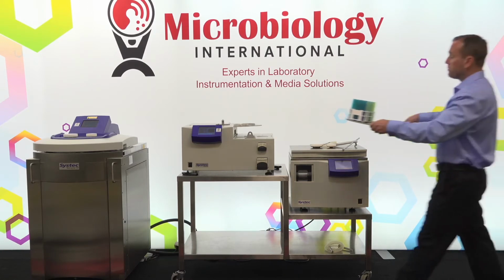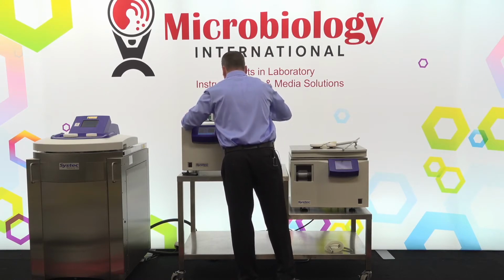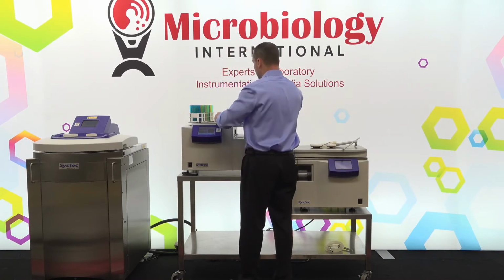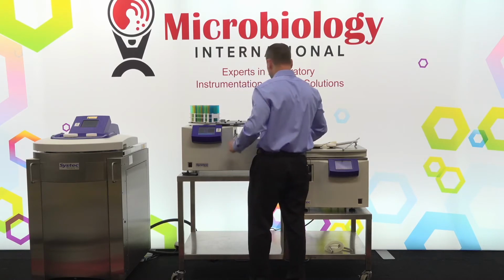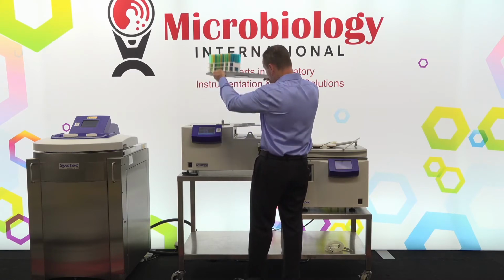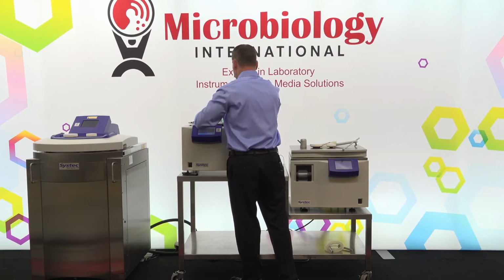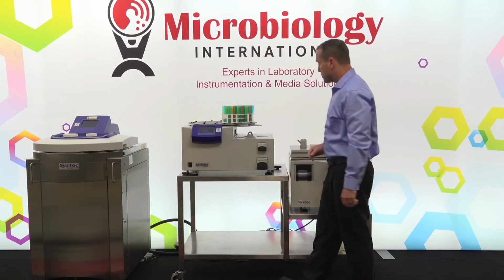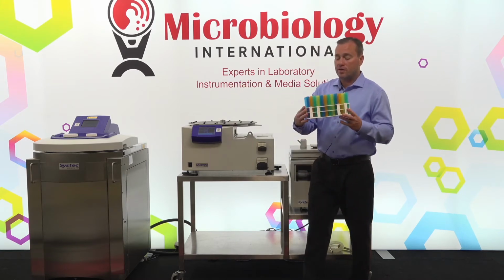So the tube filling plate fits very similar to the carousel. It would rotate into position, and then it would set down. Let's find where that is. So once it finds its position, then we would have the ability to put up to 4 racks of these.